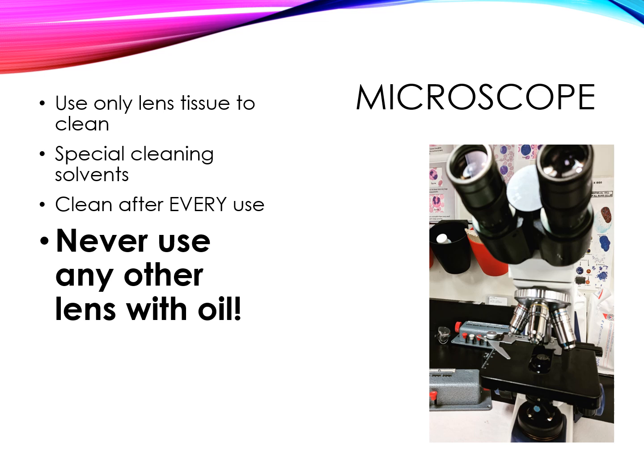Some of the things to keep in mind with the microscope: you do want to alcohol the eye objectives before and after use, and clean the microscope after use. You can clean the stage of the microscope, and also the objectives, with lens paper. We want to clean this after every use, and always remember, as far as the oil, you do not want to get the oil on the other objectives. They're not meant to have oil on them.